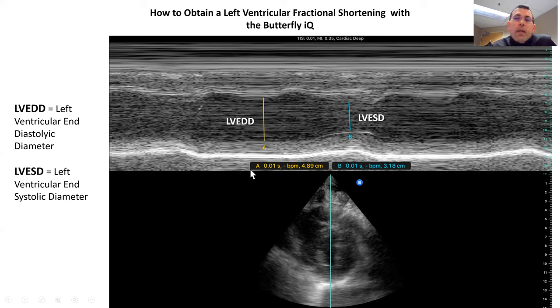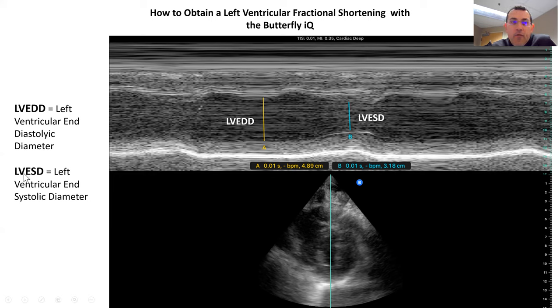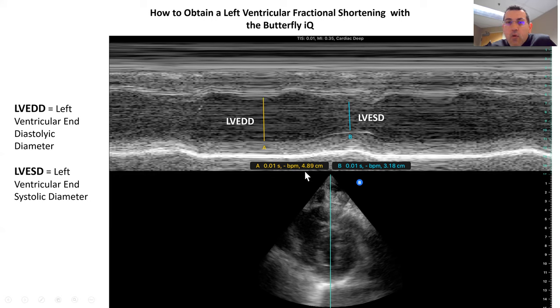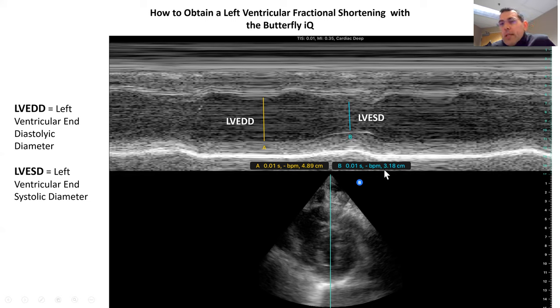When we have this pattern, we're able to get a left ventricular end diastolic diameter and a left ventricular end systolic diameter. The first line gives us the left ventricular end diastolic diameter — a value of 4.89 centimeters. And here we have our left ventricular end systolic diameter — a value of 3.18 centimeters.